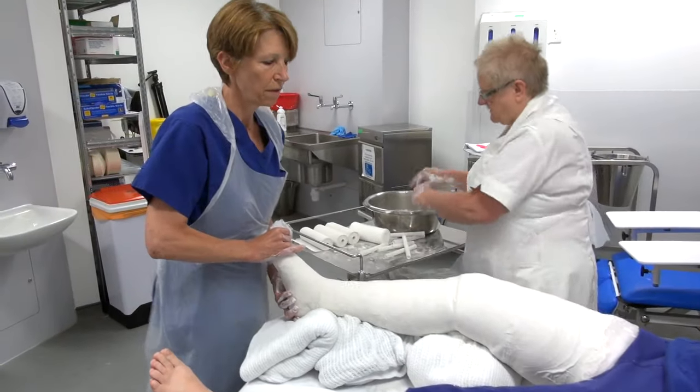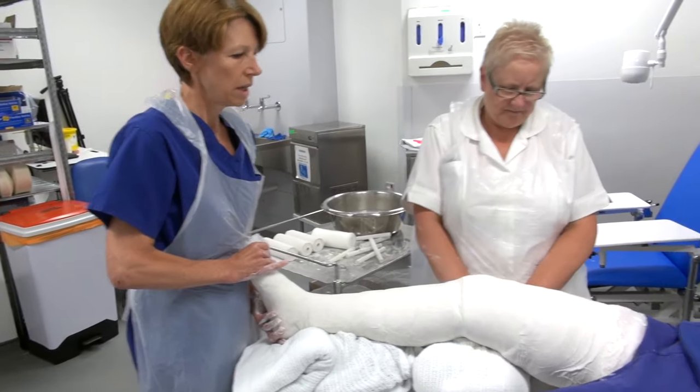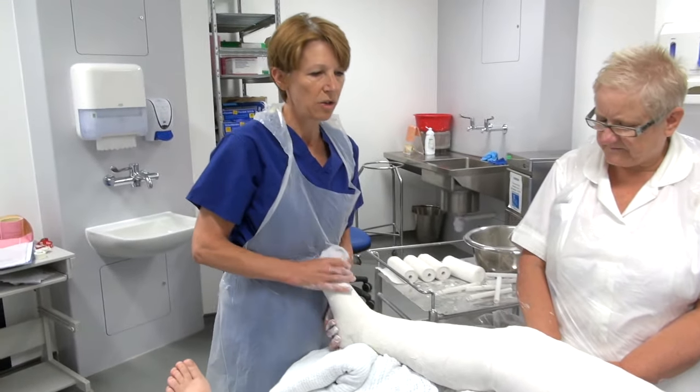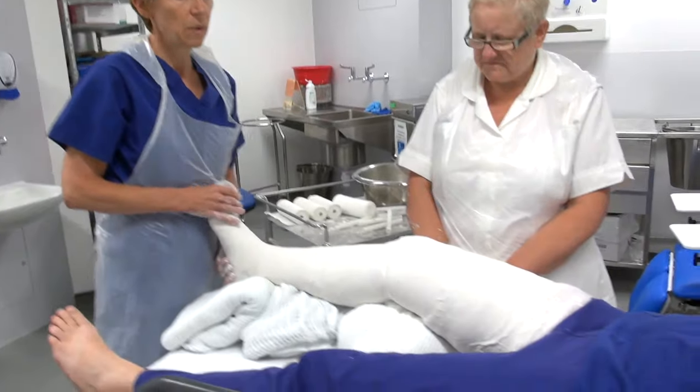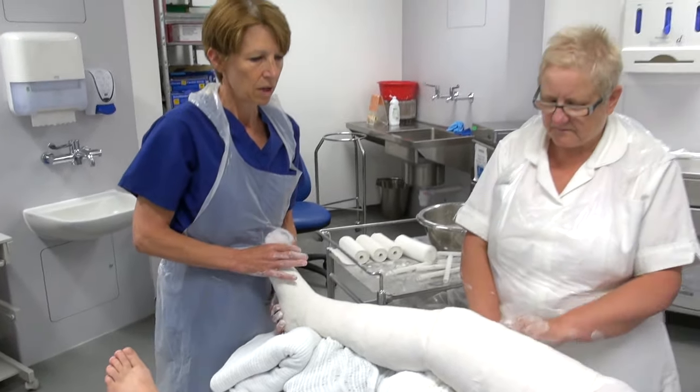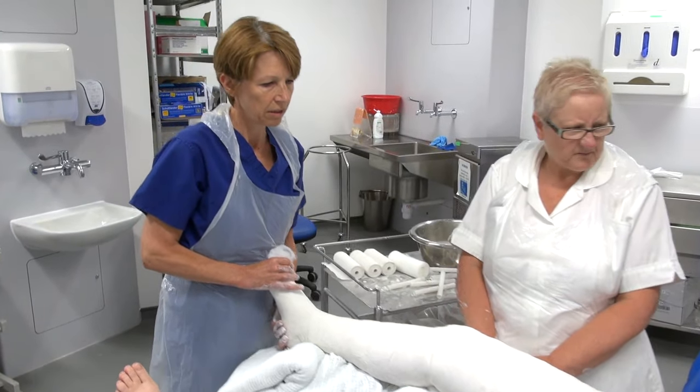Now we need to leave this to harden off for about an hour, because we will need to do a tram line down the middle just to split it, as this is a new injury. If there's any swelling, we need to allow for the plaster to expand so the cast doesn't become too tight and restrict circulation.